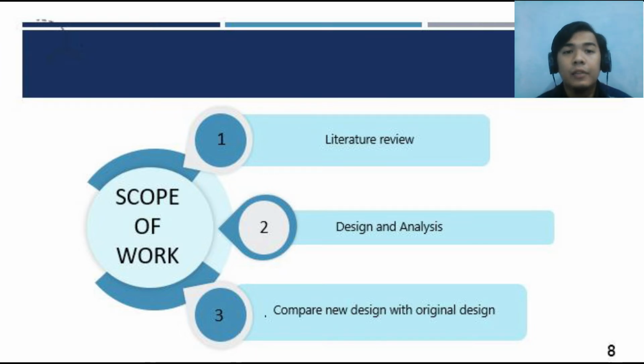The last literature review is material properties. For the femoral and tibia components, there are three different materials that can be used, which are titanium alloy, cobalt chromium alloy, and stainless steel. For the tibia insert and patella, the material used is ultra high molecular weight polyethylene (UHMWPE). Materials with different characteristics need to be analyzed in order to find the best material for the component.